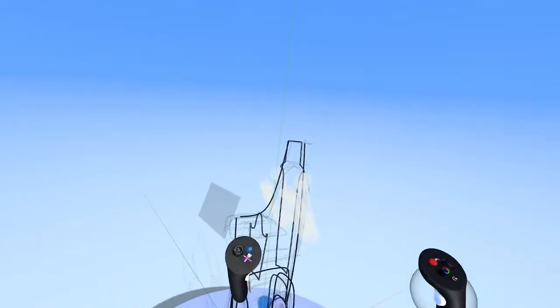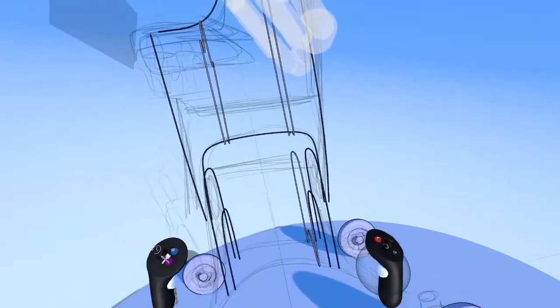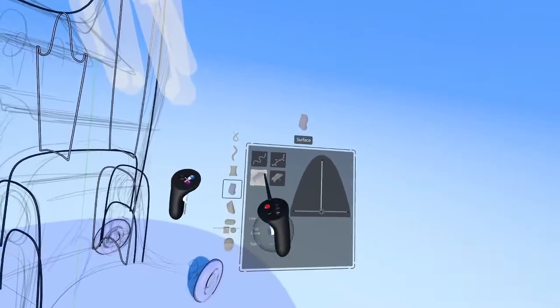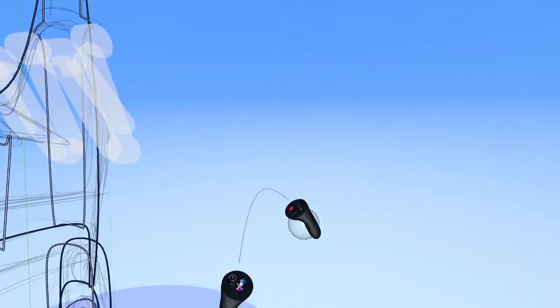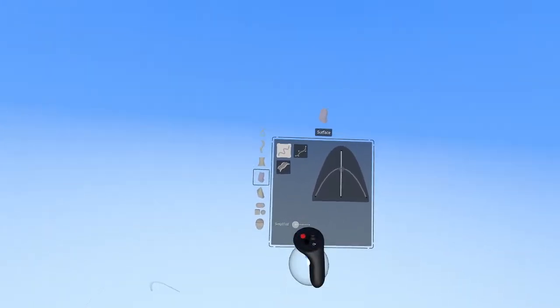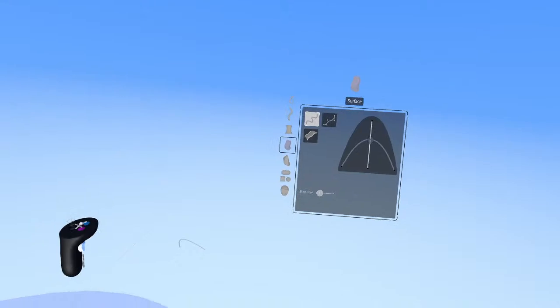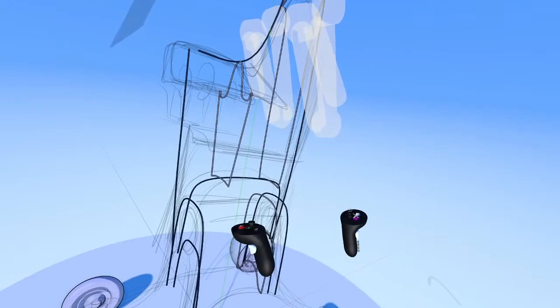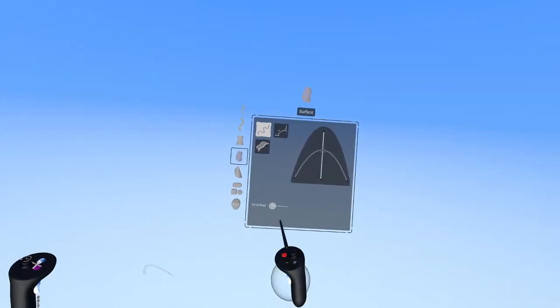All right, so now we're ready to surface, and you saw a little bit of that there. What we're going to do is use these curves to create surfaces. So we will select the surface tool here, and this is what it looks like normally. On the graph, it has some tension, which allows you to sketch with some shape. It's turned to simplified geometry, and it's on mixed input mode, so that it allows you to just very freely put down some shapes. Because we're doing an industrial design project, and we have curves that we created that are nice and clean that we can create surfaces between and use, we're going to adjust some of the options on here to fit that better.